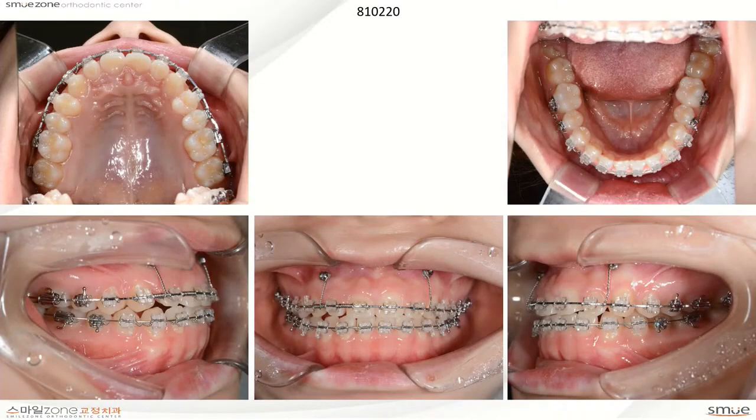And while the class II occlusion phase is in the lower, I hope to passively maintain the intrusion by ligature wire, a lobe tie like this one, to hold the intrusion while wearing the class II elastics so that it does not return.